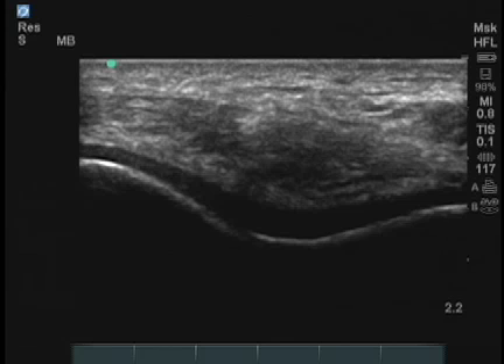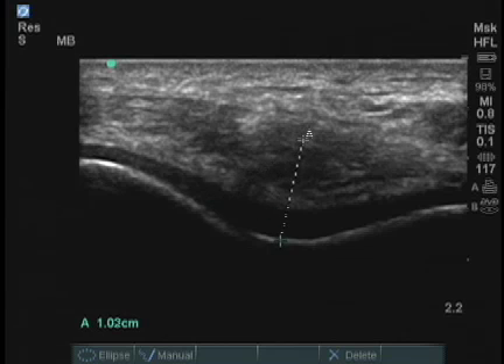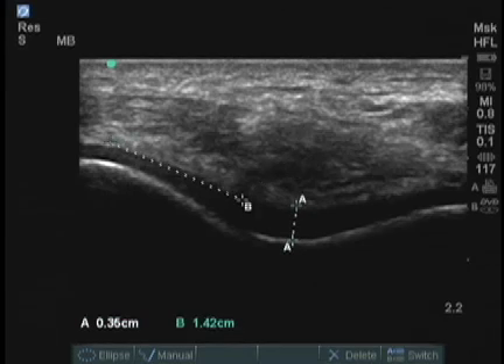By freezing the image, I can now measure the cartilage thickness. I press the caliper button and I locate the center of the cartilage and I can measure the distance of cartilage thickness. I can measure the cartilage thickness at the point of each lateral condyle and compare these to normal values.